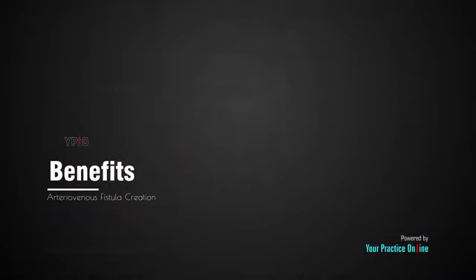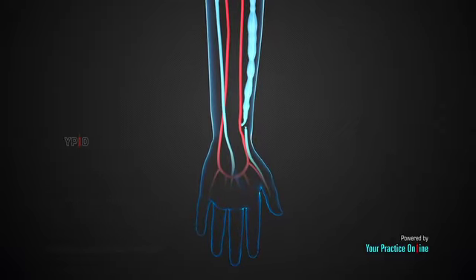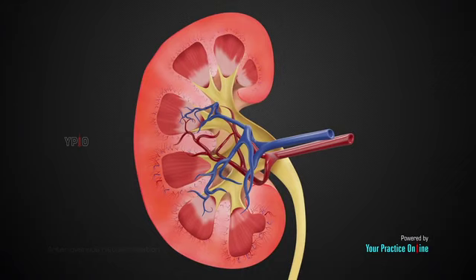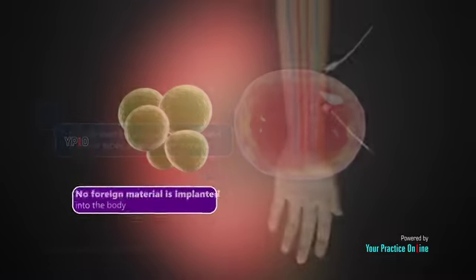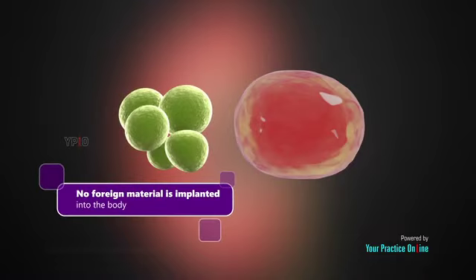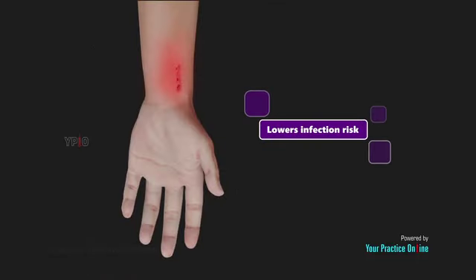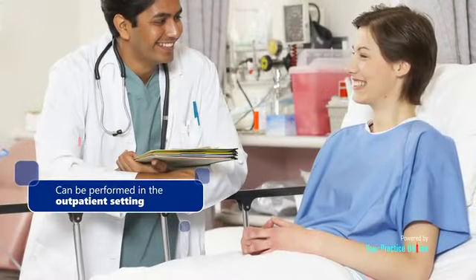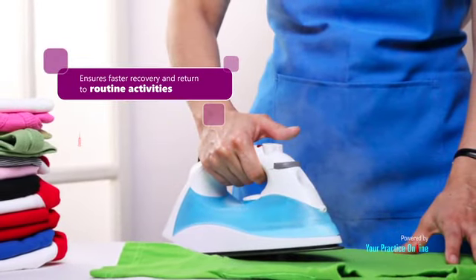Benefits of an arteriovenous fistula. Some of the benefits of an AV fistula in the treatment of end-stage renal failure include: can be used for a longer time compared to other types of vascular access. No foreign material is implanted into the body. Optimizes blood flow for effective hemodialysis while minimizing treatment time. Lowers infection risk. Can be performed in the outpatient setting. Ensures faster recovery and return to routine activities.